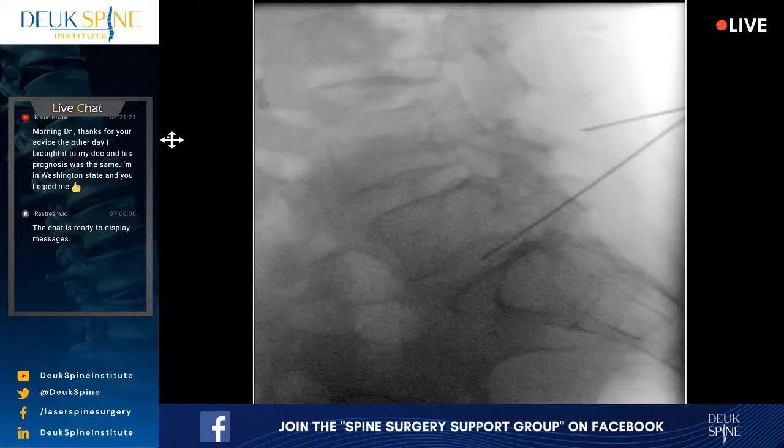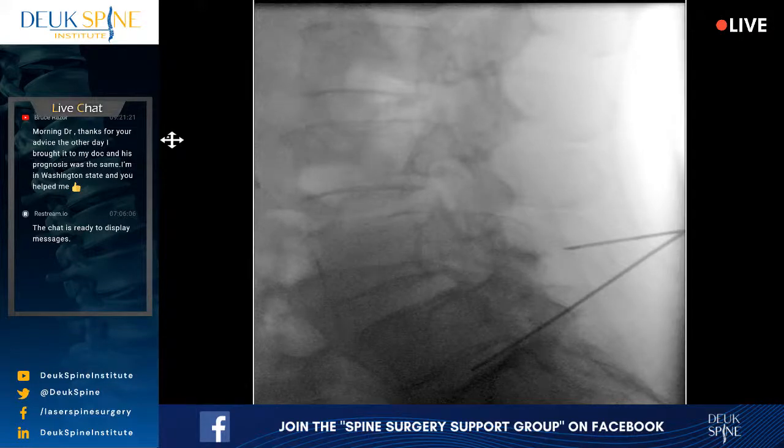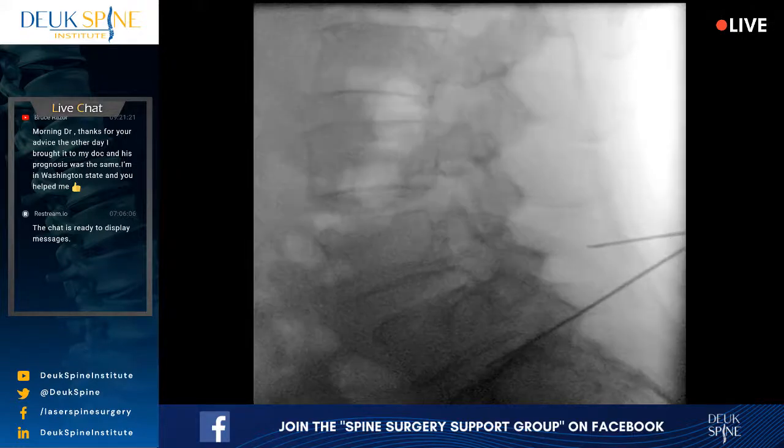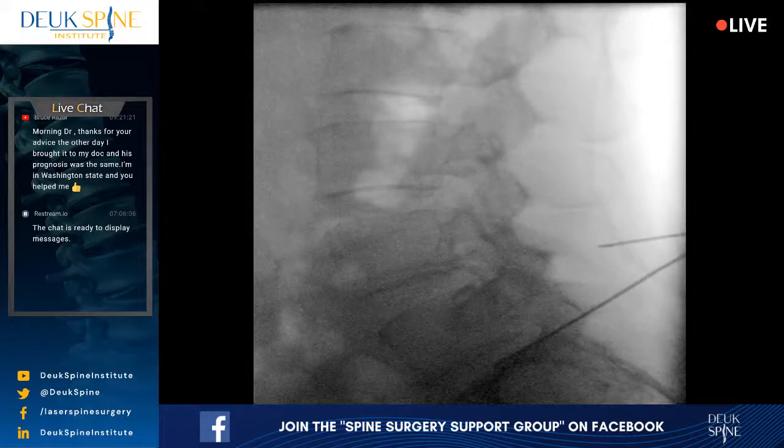Come on, Jordan. Come on. You should be more north, okay? The only reason you're this far south is because of the scoliosis at 5-1. Your brain should say, all right, we need to be a little more north. And your orbit is off. You're way too orbited. No, that's better. You're almost there. A little bit more. Maybe a degree.